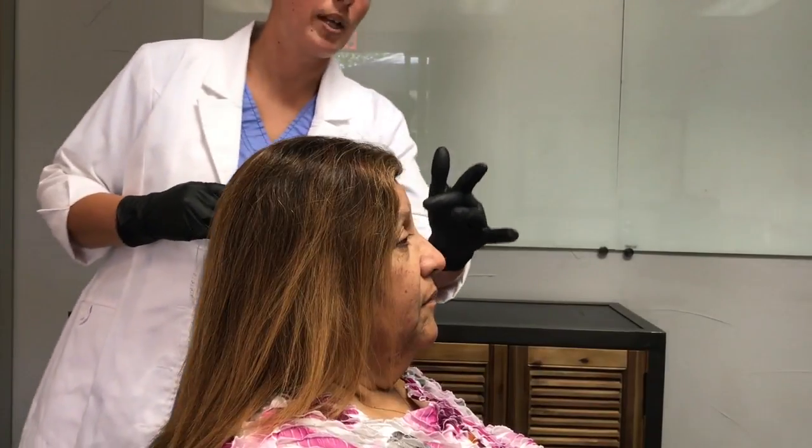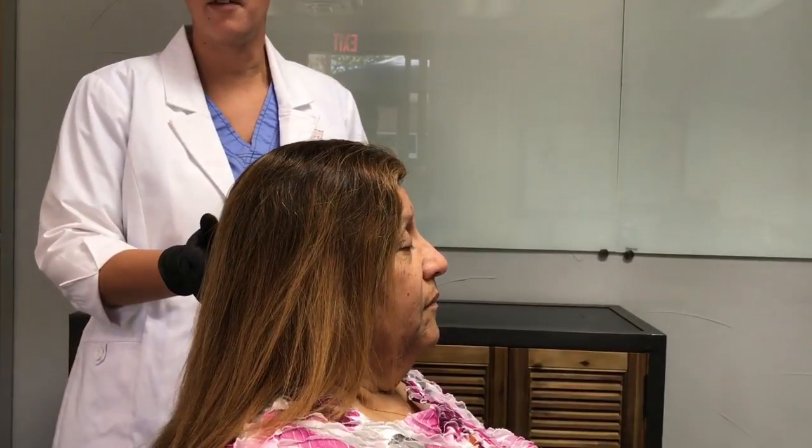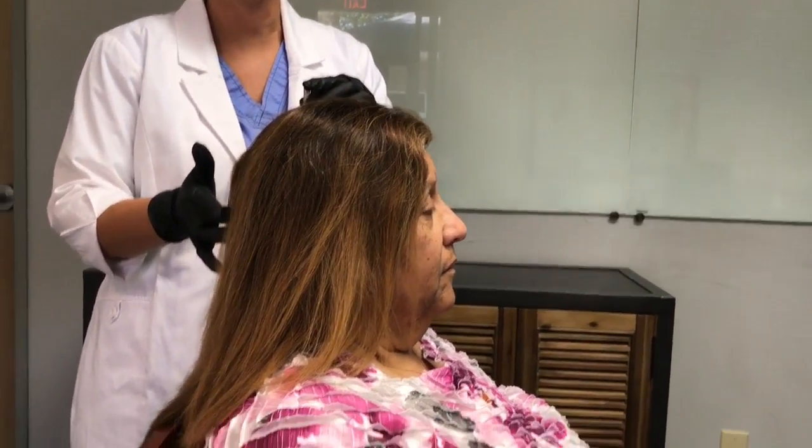I will begin by measuring and marking the patient's head according to the 10/20 International Electrode Placement System. There are four anatomical landmarks used for the essential positioning of the electrodes. First, the nasion, which is the point between the forehead and the nose. Second, the inion, which is the lowest point of the skull from the back of the head and is normally indicated by a prominent bump.